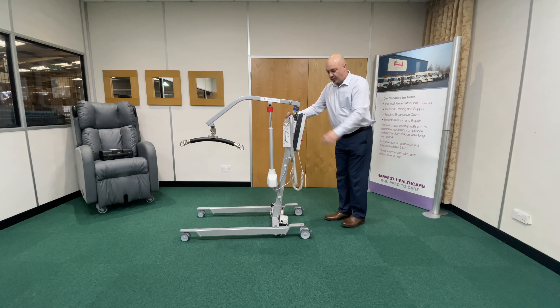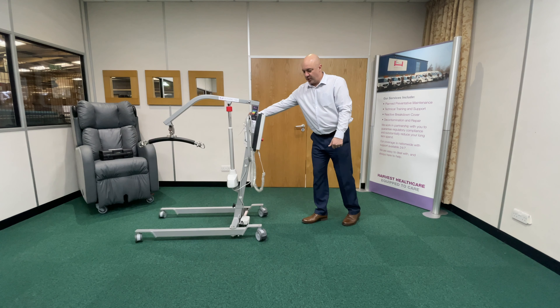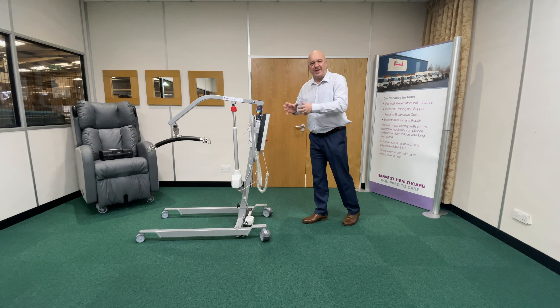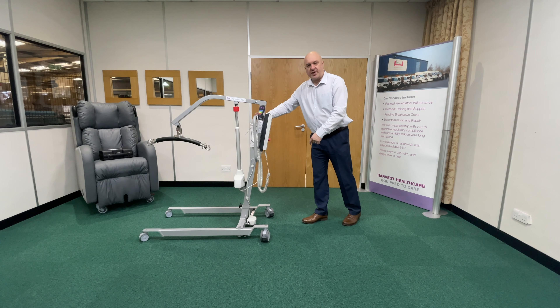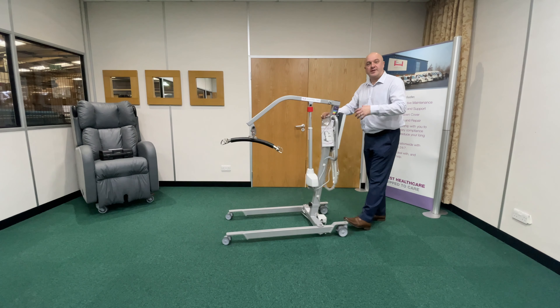If I push the hoist forward, you'll see the casters at the back here are facing backwards. If I stop and pull the hoist backwards, they kind of screw into the carpet and get stuck — they get stuck sideways and pause, and you end up trying to pull the hoist back to turn those casters around.